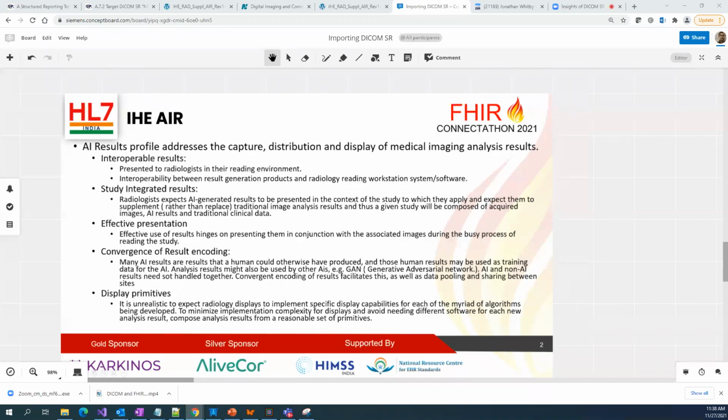The advantage of IHE is, if you are developing a product which follows the IHE standard, then one thing, it is easier to implement because there are well-defined communication protocols.